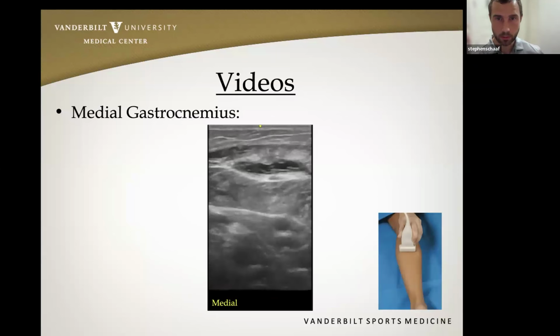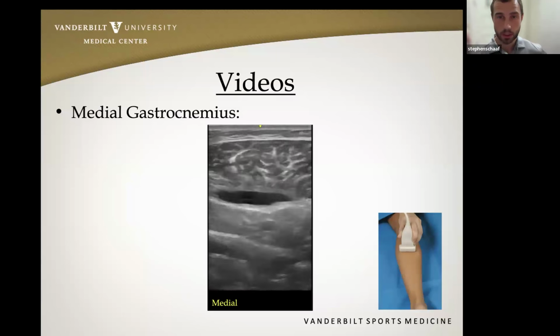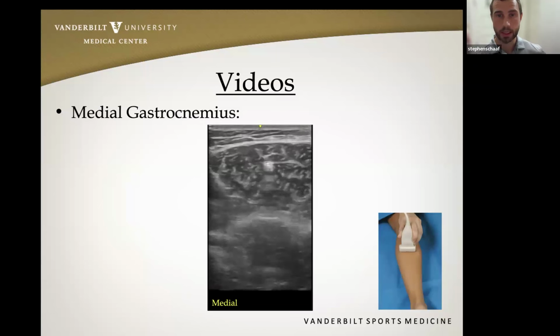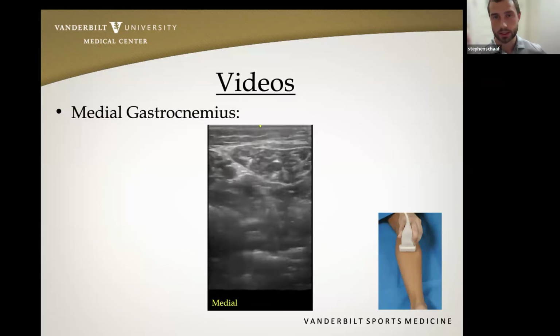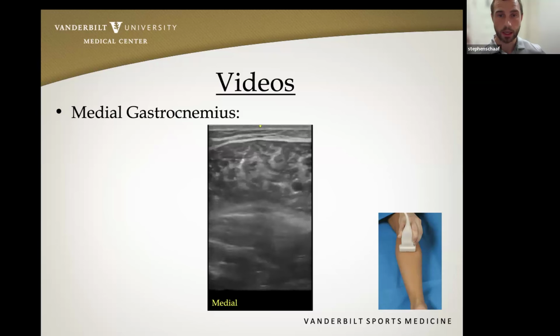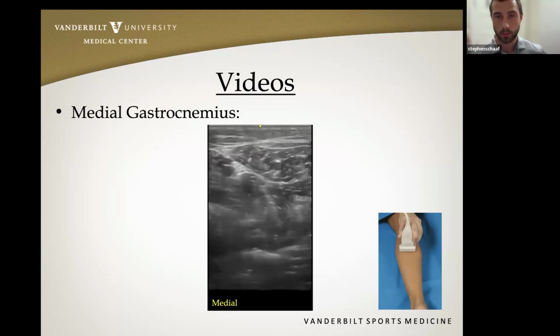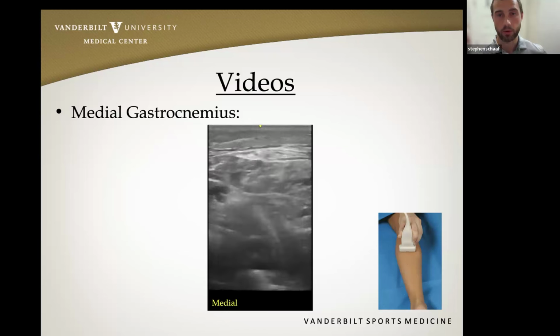So for these injuries, it's important to note that they can be very large. Sometimes doing either a larger field of view image or even a video can demonstrate that. Here we're seeing this injury in its entirety as we're scanning from proximal to distal in this area. You really get a sense of how large that muscle injury is, as well as the hematoma formation.